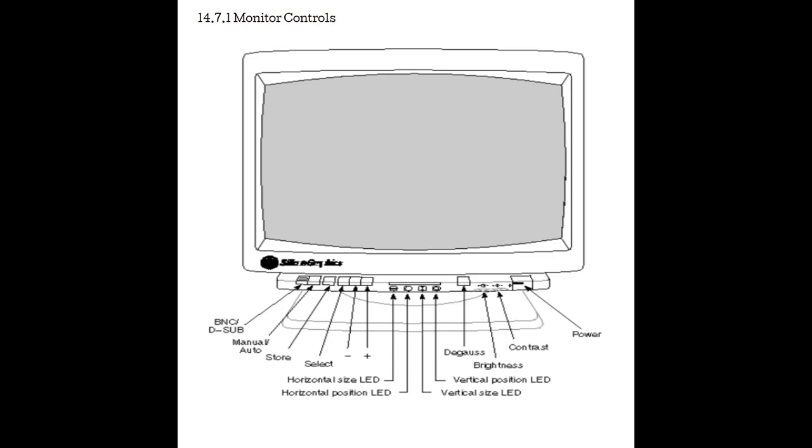Your personal preference for your own screen's display is where it ends. None of those changes end up in your pictures. But that being said, you still have to have your monitor controls set appropriately to visualize the pictures appropriately. So two things that you can change on your monitor are contrast and brightness.